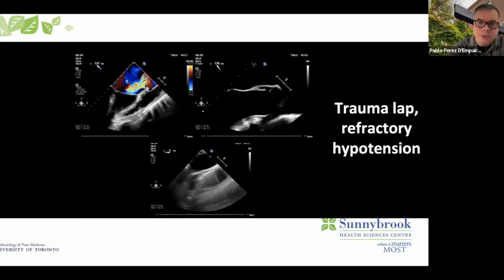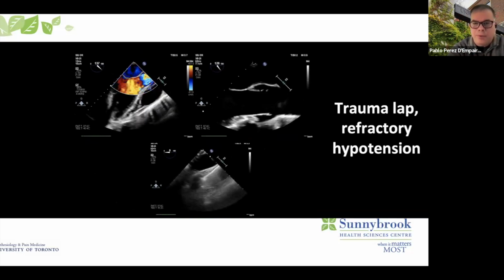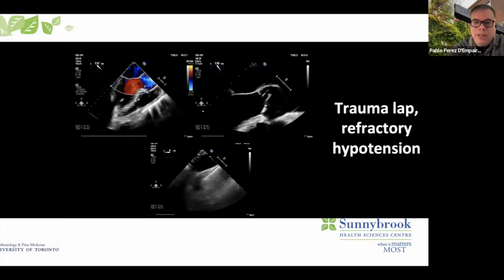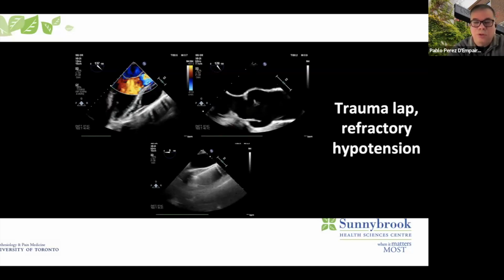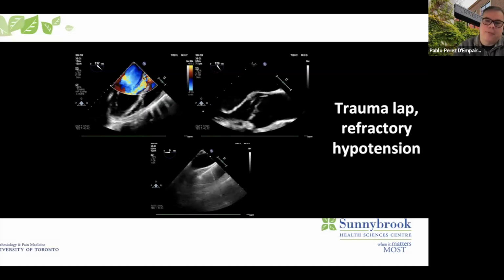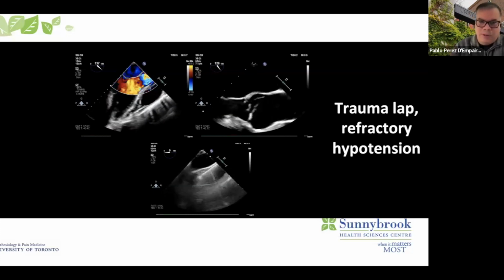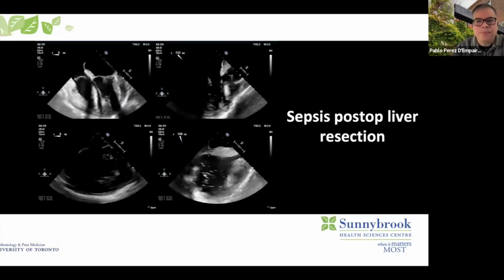You can see that there's an avulsion of the leaflet causing wide open aortic regurgitation, quite unusual after chest trauma, because it was an isolated injury to the aortic valve with no involvement of the root or other traumatic aortic tear, which is what you commonly see in this type of patients. But obviously, having this diagnosis then led to improved management of this AI. And eventually, after he recovered from all his injuries, he went for aortic valve replacement.